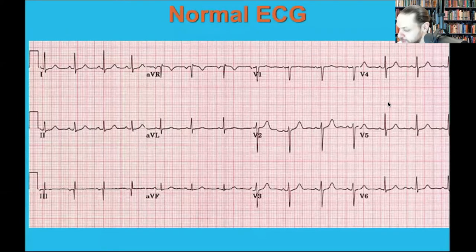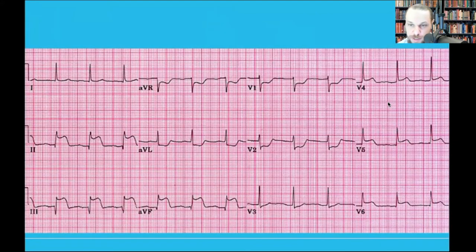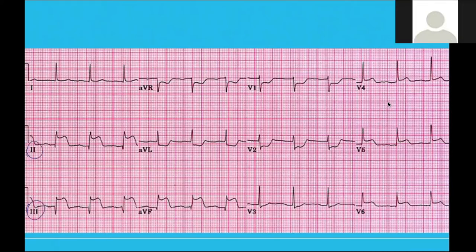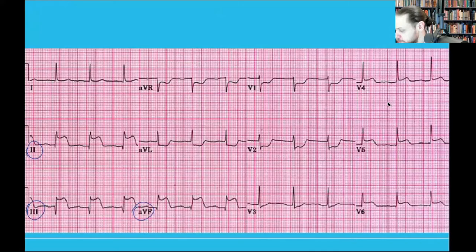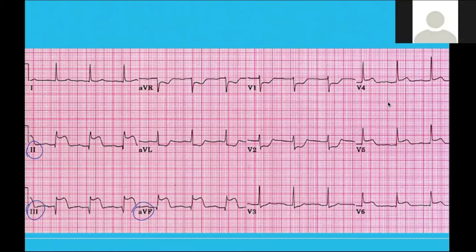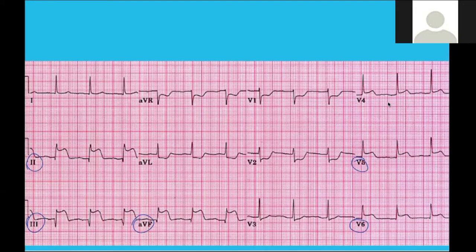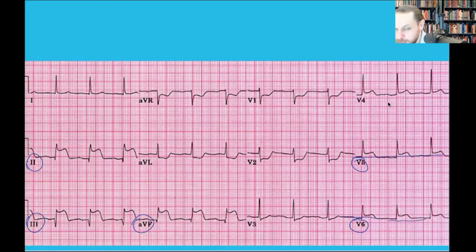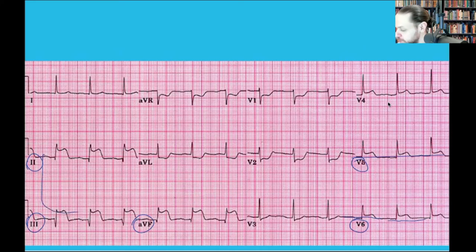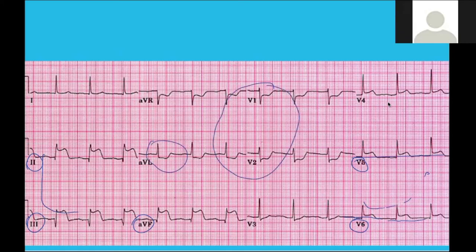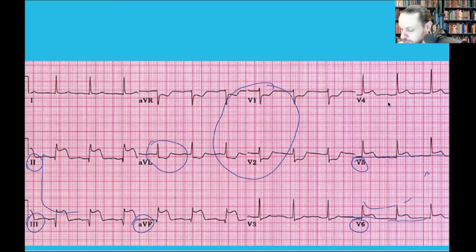Here's a normal EKG — no elevations in any leads. Now this next EKG: where do you see elevations? Leads II, III, aVF — and also V5, V6. All of those are elevated. You also have reciprocal changes — the opposite side showing depressions. You see the posterior wall showing depressions. This is pathognomonic of a STEMI.